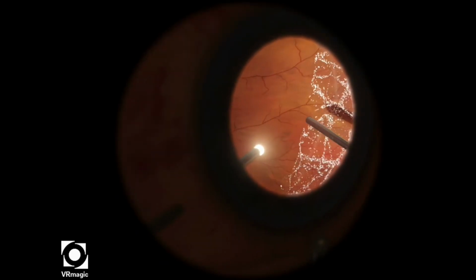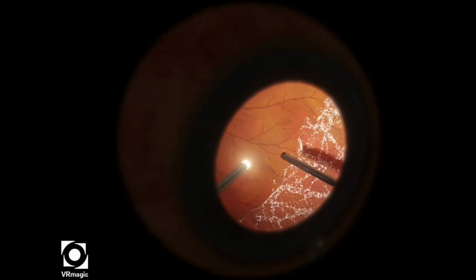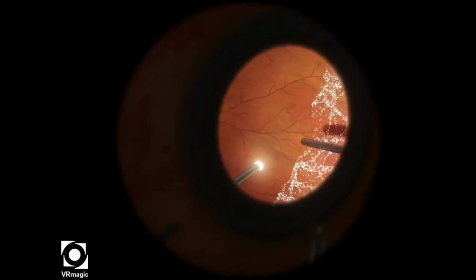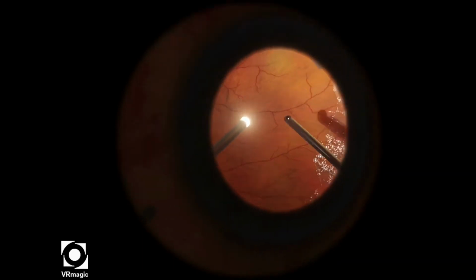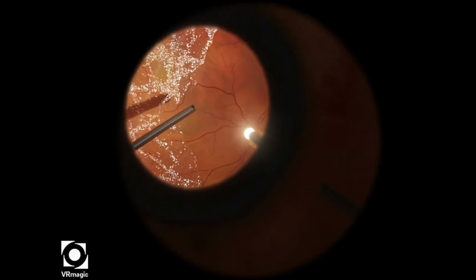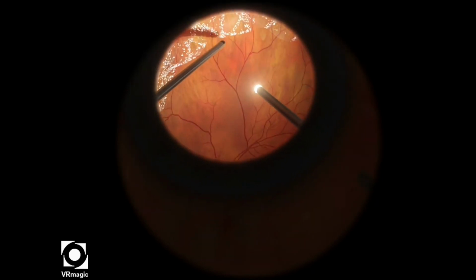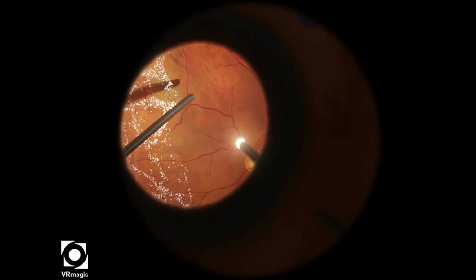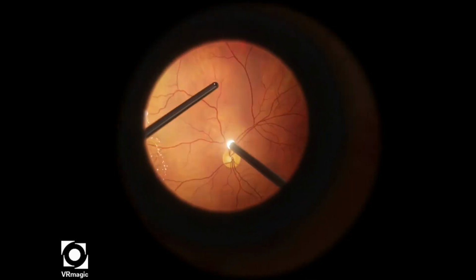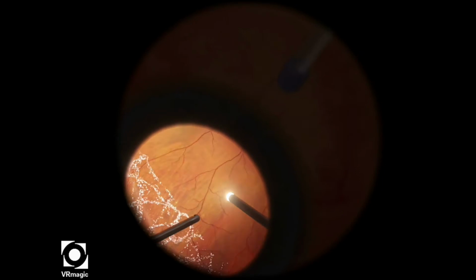So here you notice that I'm reversing the vitreous cutter in order to get underneath the port. You could do that, or you could also switch hands and use your left hand to get underneath the right trocar or right port as well. And I've switched hands and gone back to doing the same thing on that side. I just want to be able to visualize the vitreous a little bit better, so this is why the view is a little bit more expanded than the other videos.